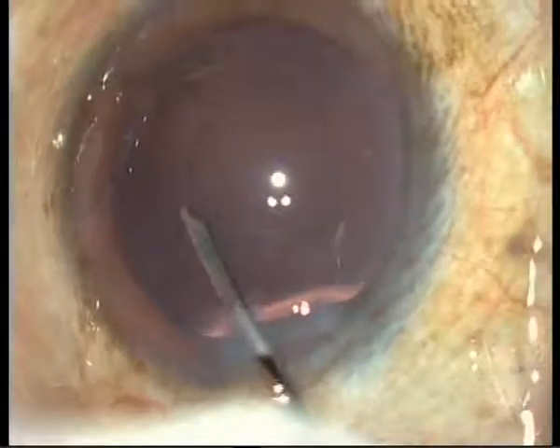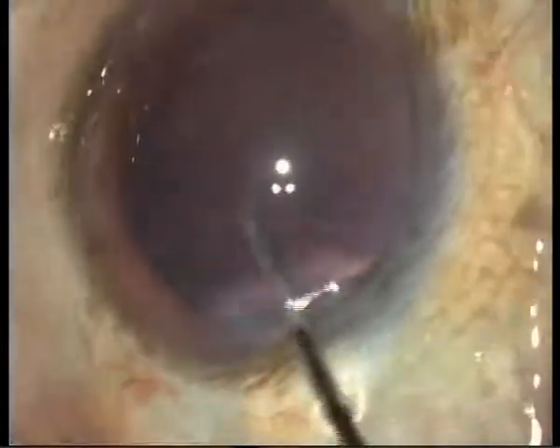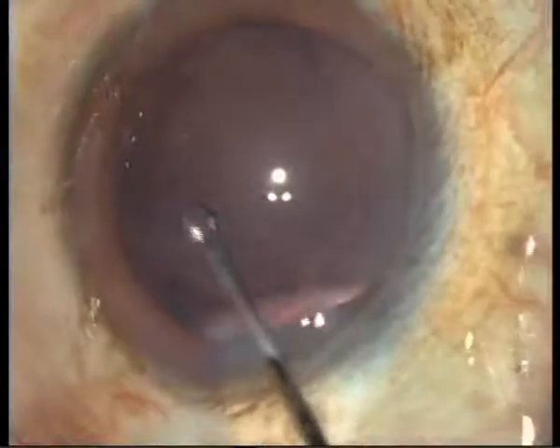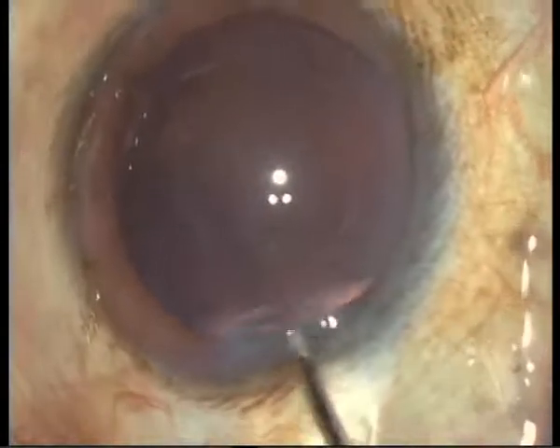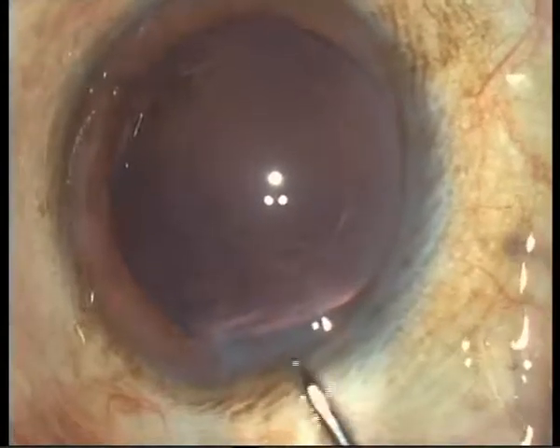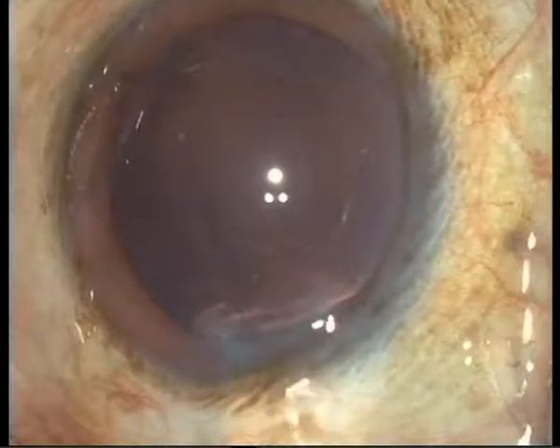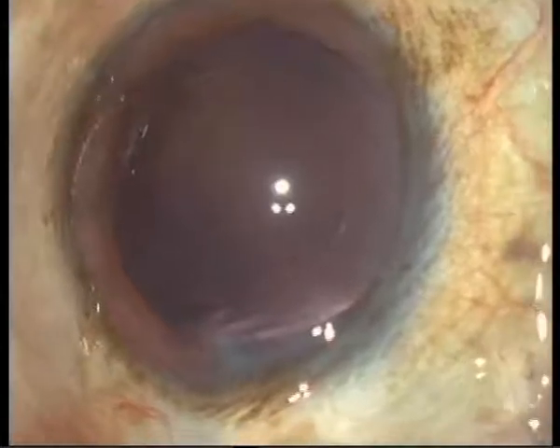She is also using the micro-capsule rhexis forceps here. Okay, I think that will do — now we are going to prepare the lens itself.